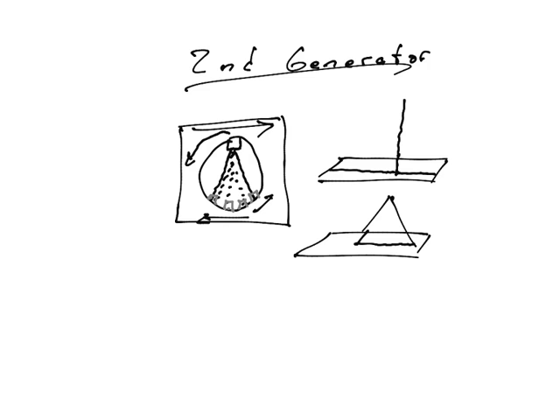So this was a big, noticeable improvement. In fact, this brought the scan time per slice from about 20 minutes down to about a minute or two, which is a huge improvement.